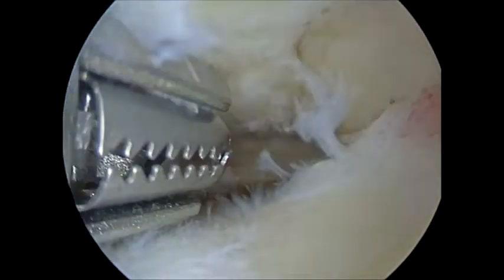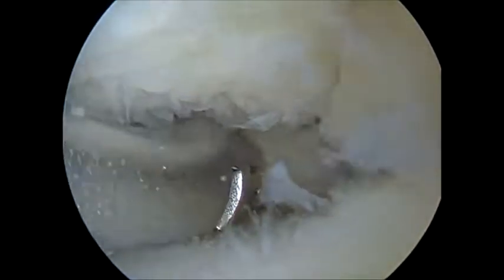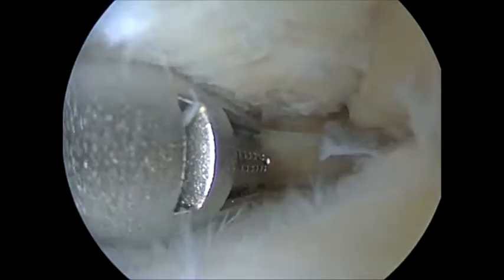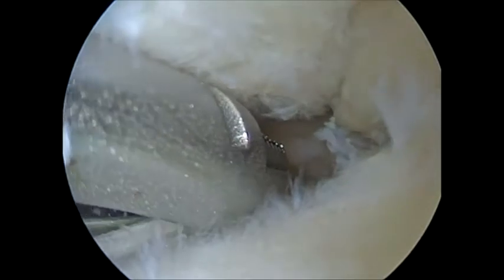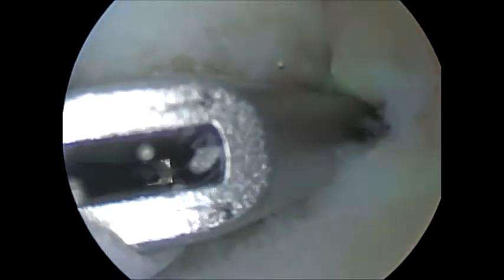The second part. The first suture passer was inserted from the anteromedial portal and the suture was passed through the torn medial meniscal root.